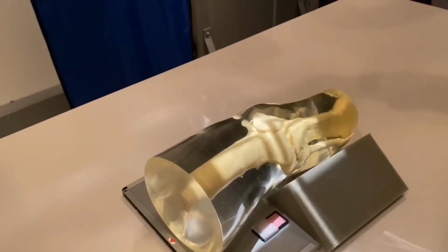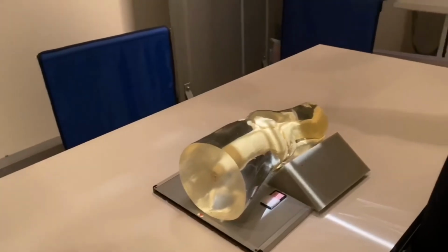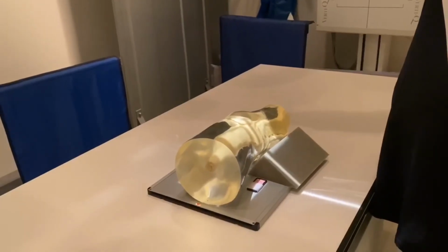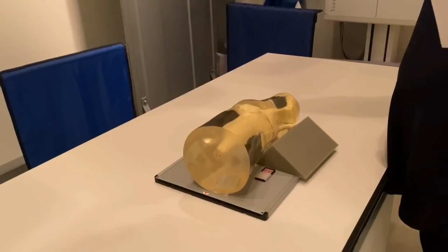Use the little sponges to support it. And then you're going to have two different KVPs. One will be high, one will be low. So you may be doing maybe a 40 and a 70, a 50 and a 90, a 60 and a 100. We're going to be doing different ones like that to show the difference.